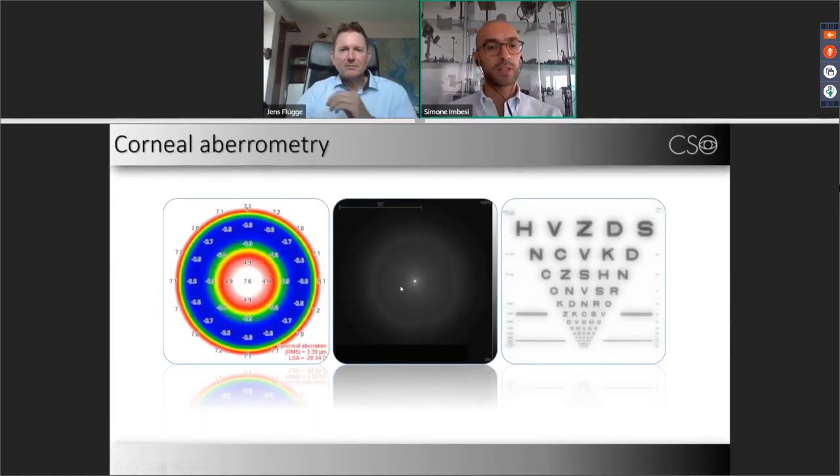Now I'm displaying the spherical aberration. The spherical aberration is an aberration that occurs when a bundle of rays that meets the cornea have different positions of focus. In particular, when the rays that incide in the central zone have a different focus with respect to the ones that come into the peripheral zone.